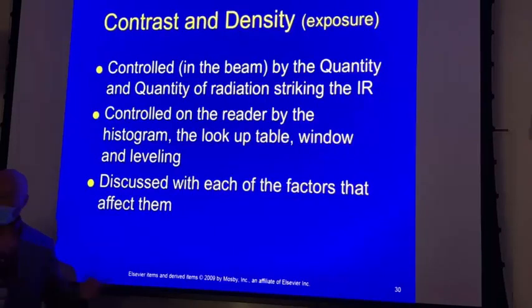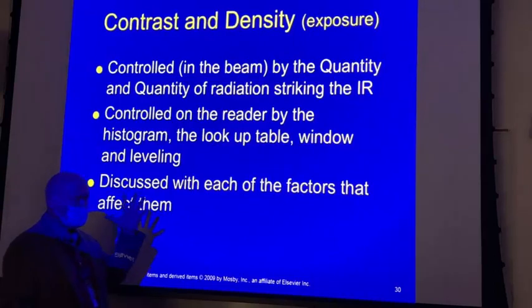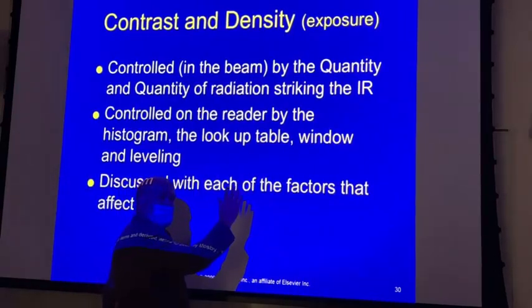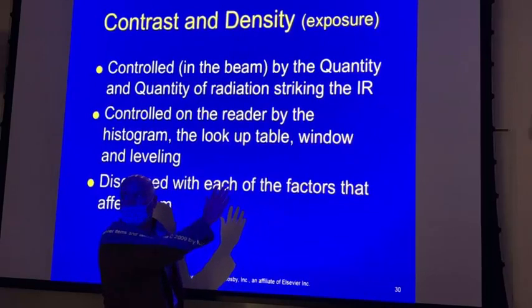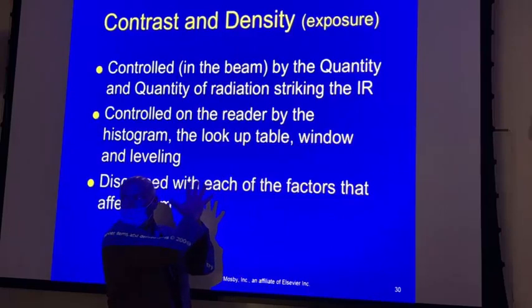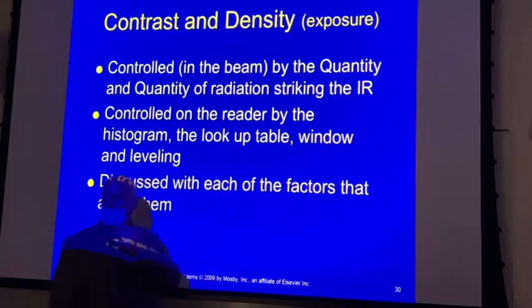And that process of processing it is what you call automatic rescaling. So you make your exposure, and it says, okay, this is what you shot. This is a disaster you made of your image, right? We're gonna make it look like that. So that process is your automatic rescaling.